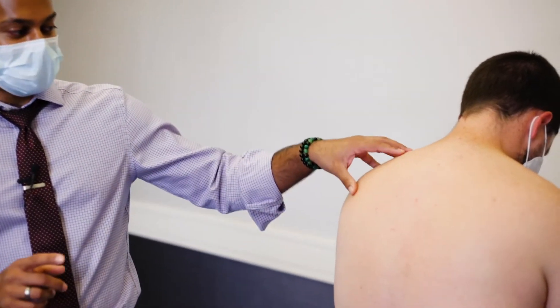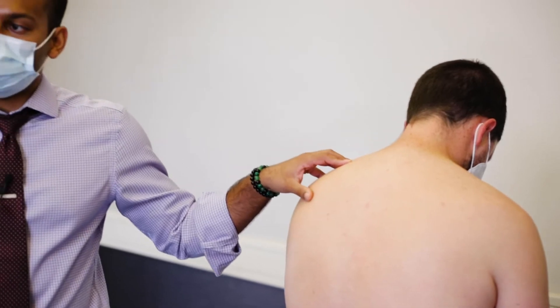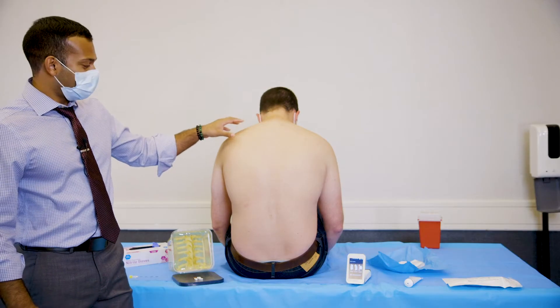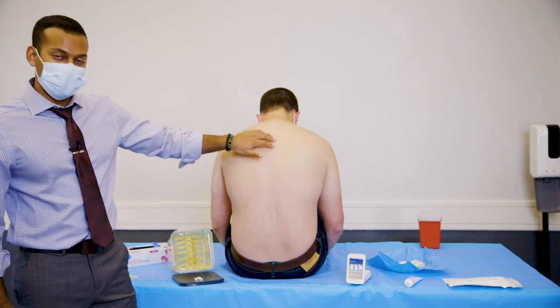The first thing we're going to do is have our patient placed in the appropriate position. For our epidurals that we do preoperatively for anesthesia, we're going to have them in a seated position with their head flexed forward, and this allows us to open up the epidural space in the thoracic spine.